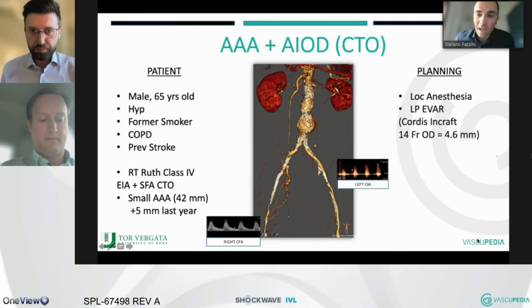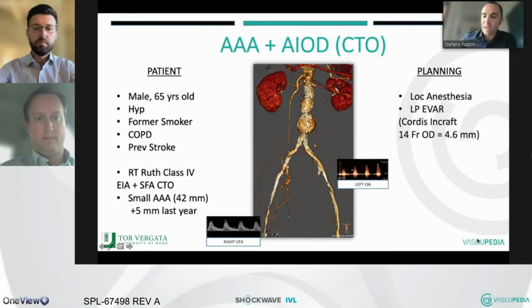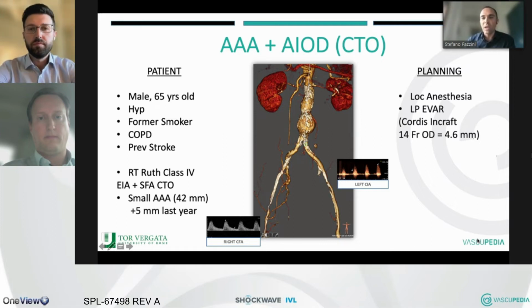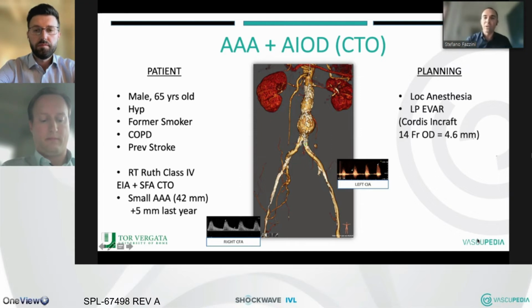Yes. Okay, it's a pleasure to start with the third case from today because we are changing the indication. As you told, Michel, we have many indications. One is graft delivery, and another is when we have an aortic disease associated with aortoiliac occlusive disease, like in this case, where we take into consideration the luminal gain, not only the vessel compliance, to increase the safety of our procedure, but also to guarantee patency and increase the flow. The main indication in this patient is the peripheral disease.